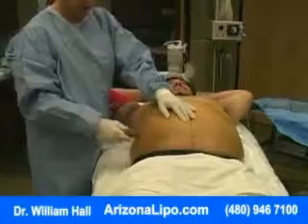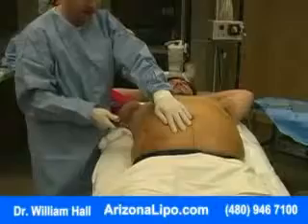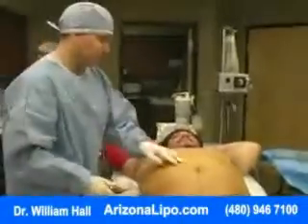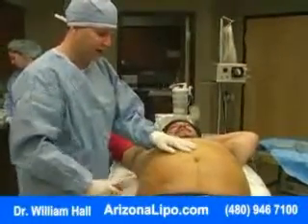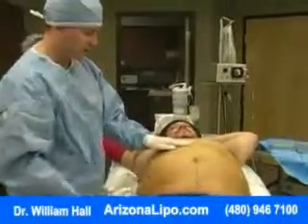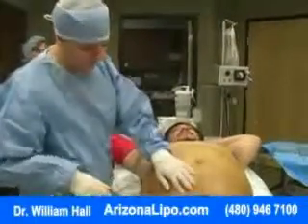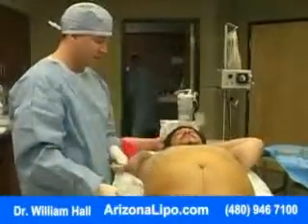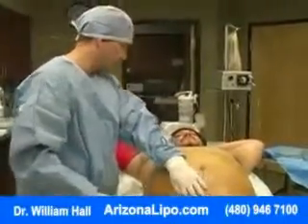Your fat feels really soft. That's good because that dictates how long the suction is going to take to get the fat out. That is all different consistencies, and what one person your size could take double the amount that another person takes. Is that right? There's just a lot of variation. A lot of people think that you just stick a tube in and the fat comes out pretty much the same, but there's a lot of variation from person to person. Right. And it's important how your fat comes out because that's the amount of time that we spend in suctioning and working on the tissue, which directly affects your postoperative inflammation and how sore you are afterwards.